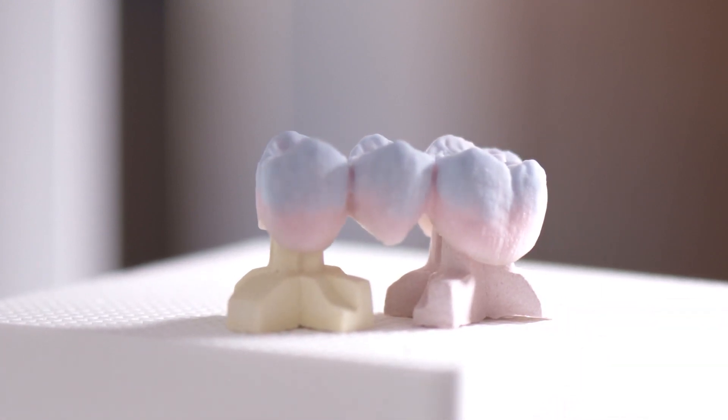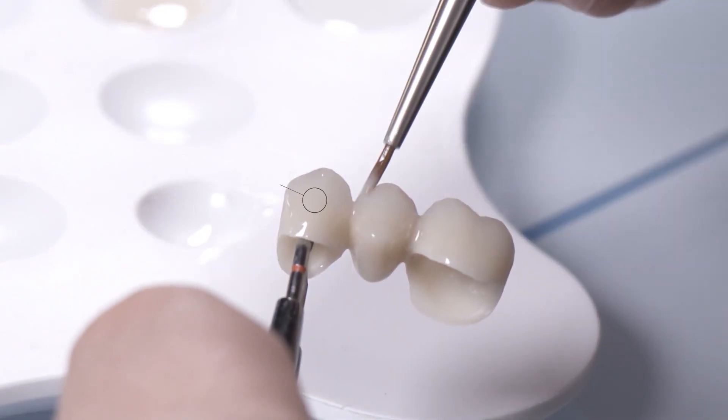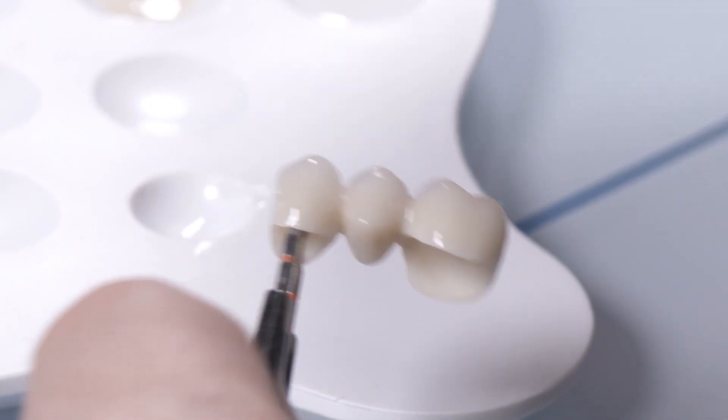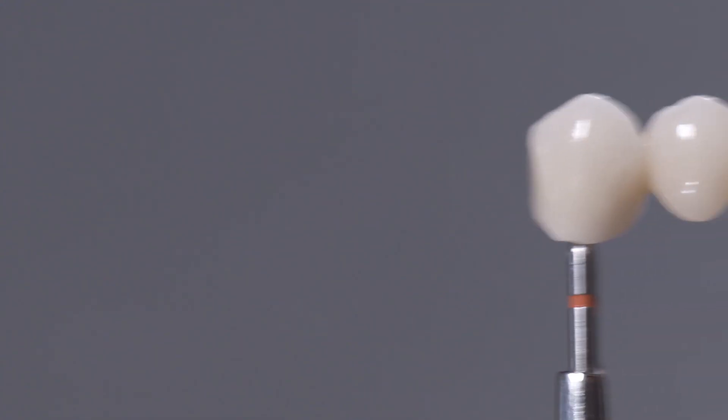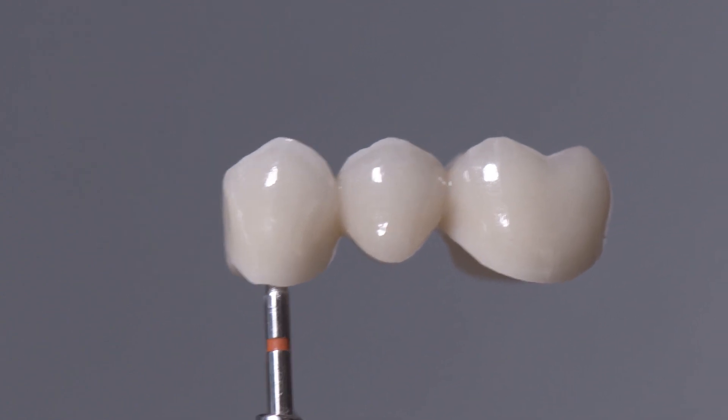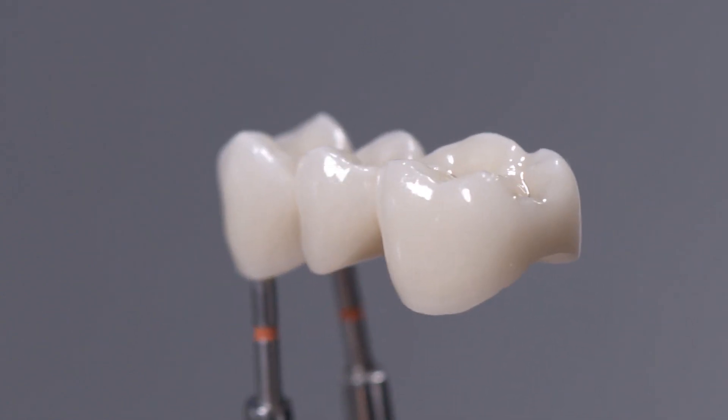In a second ceramic firing, the restoration is finished using only Dentin A2 and Enamel E1. Customization with stains was deliberately omitted in this case. The Circon HD restoration is finally glazed with High Flu Universal Overglaze. The result, a restoration that matches the desired target shade perfectly.